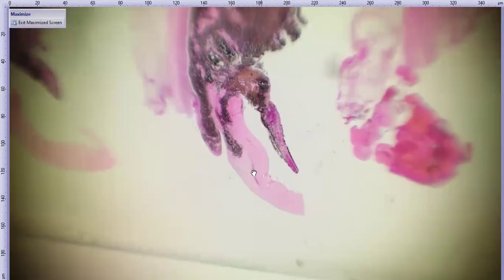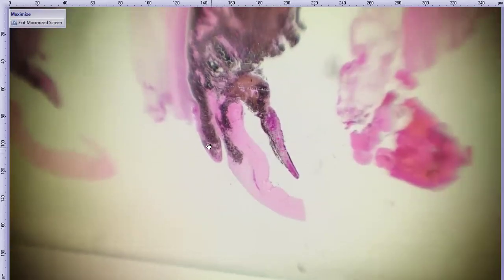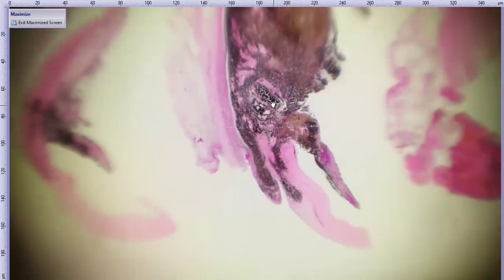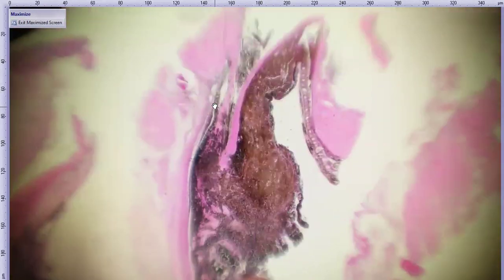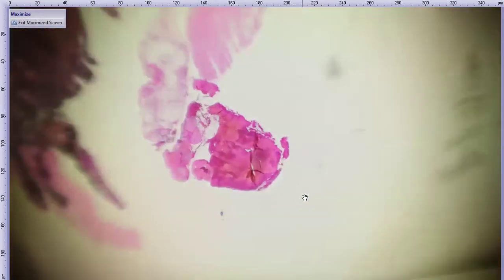So here is the cornea. Here's where you can see a more brown tumor that's bulging up into the conjunctival substantia propria. It's greatly expanding the ciliary body here, and it goes right through the sclera into the episclera. So, in the interest of time, I think I will just stay with this slide.